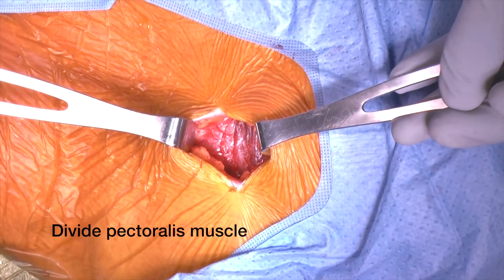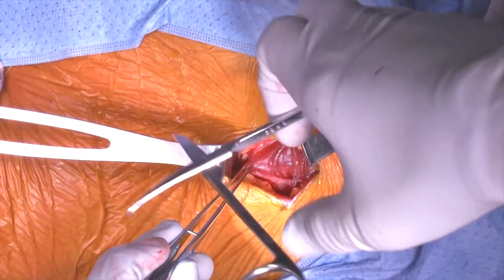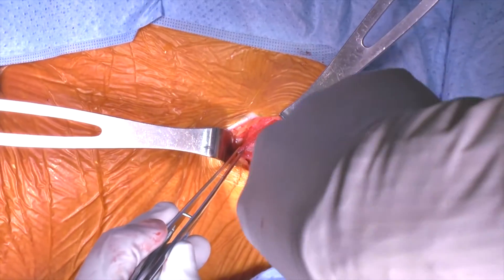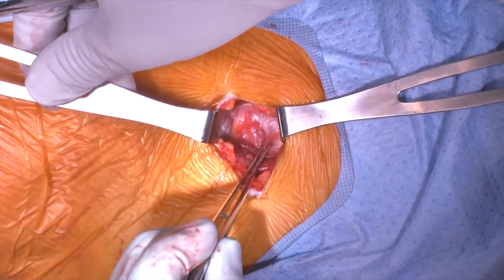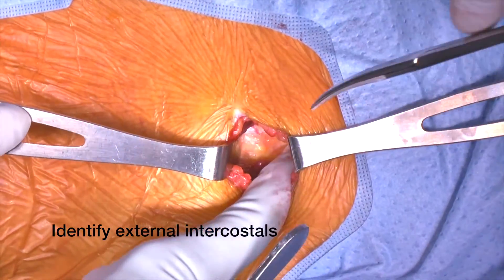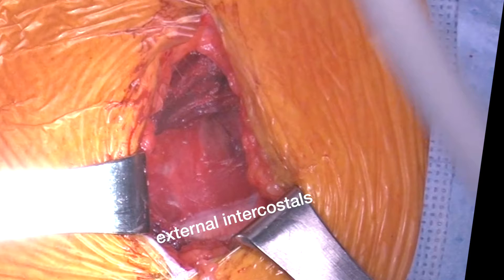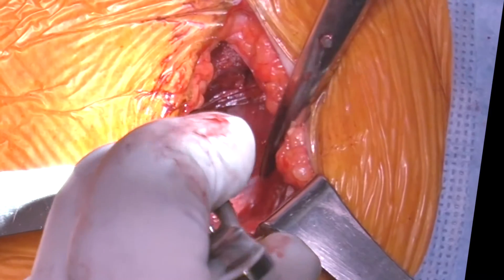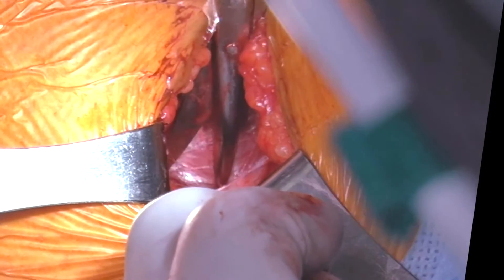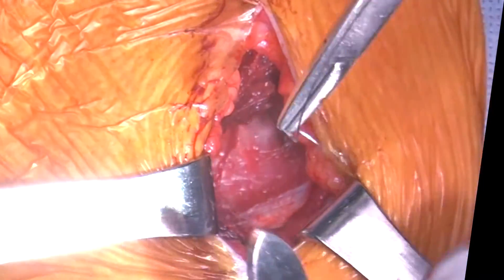Now we're going to move on to placement of the respiratory lead. We spread in the direction of the pectoralis major muscle fibers overlying a rib space and gently separate the muscles. We don't use cautery or sharply divide the muscles in these cases. Once we have the muscle fibers spread and separated, we identify the intercostal muscles where we're going to place the lead itself. We have the internal and external intercostals — the internal intercostals will be seen more medially on the chest and the external intercostals come into play more laterally, and you can see the direction of the fascial fiber change, which is how we determine the space at which we're going to place the respiratory sensing lead.